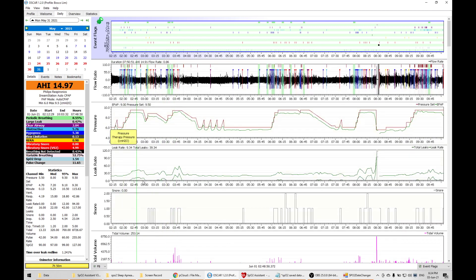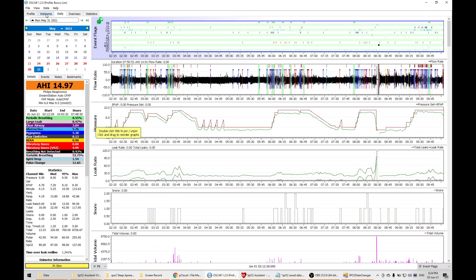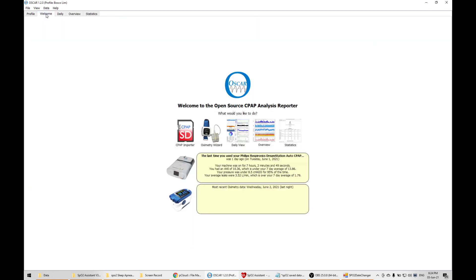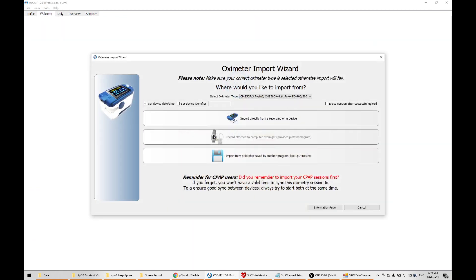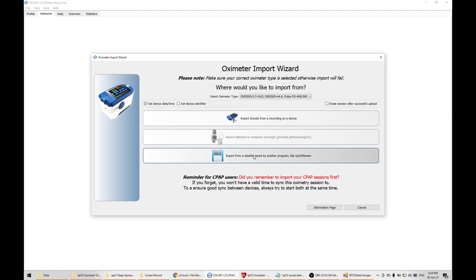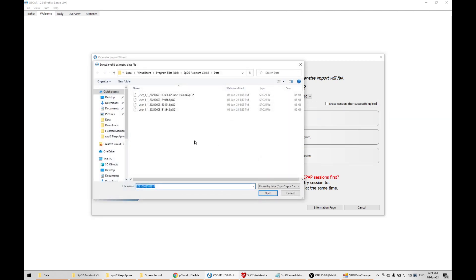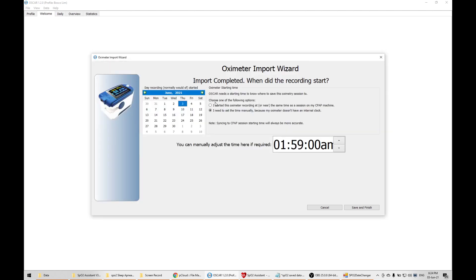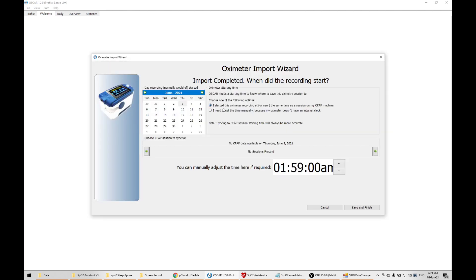You actually start the CPAP machine with your device at the same time. I started the oximetry recording near the same time, so it matches with the same time.